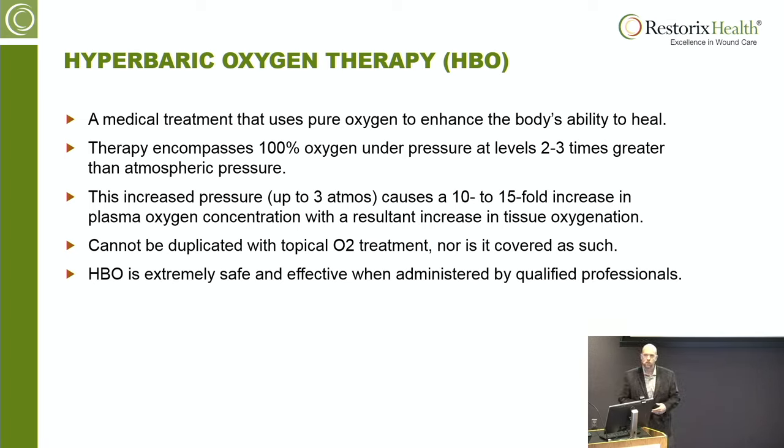Patients may ask that too, and that's why it's helpful for the staff to be able to talk through that with the patient. You also may hear about altitude bags. They're soft shell hyperbaric chambers. So when you get a chance to tour the unit, when everything's done, you're going to see the big fancy hyperbaric chambers, big tubes, 36 inches in diameter, something like that, that the patient lays in. But you can buy these little bags. So folks say, well, isn't that the same thing?